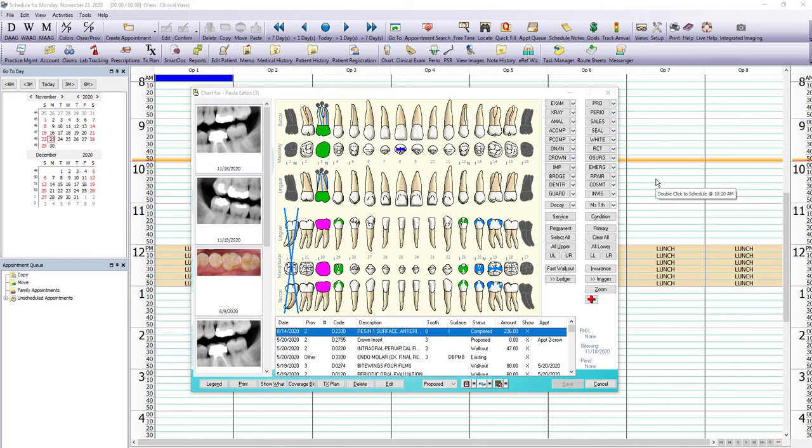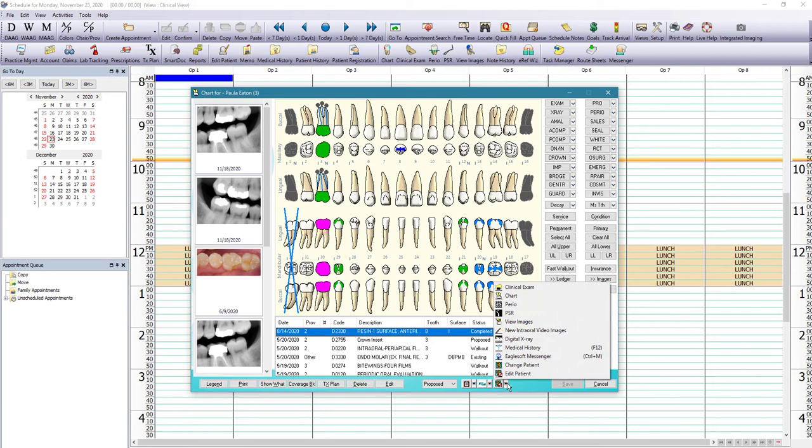So from the chart module, the third button on the bottom right, you can get to view images.